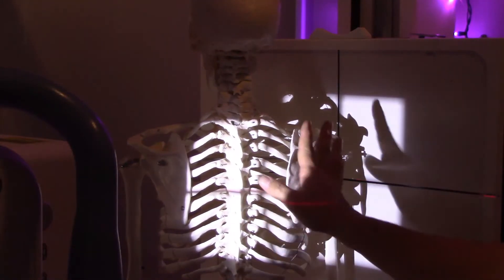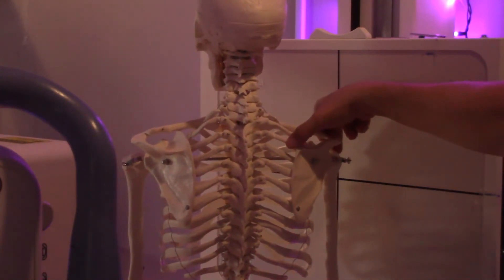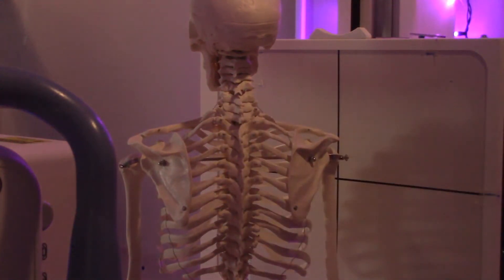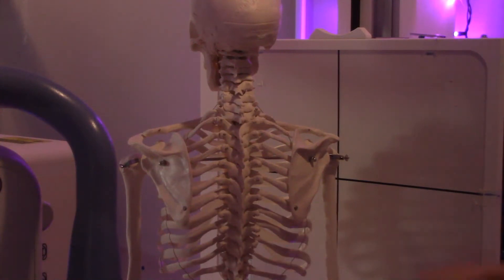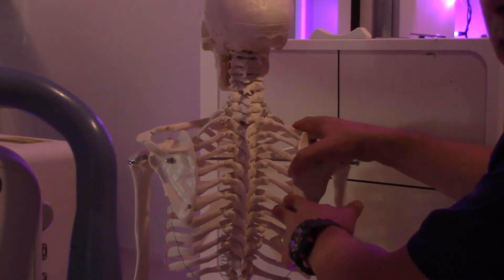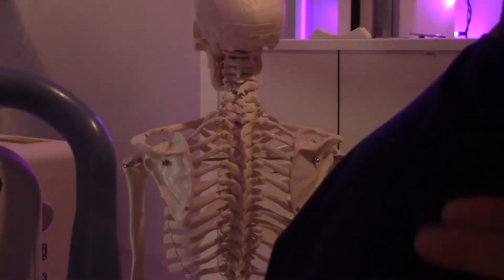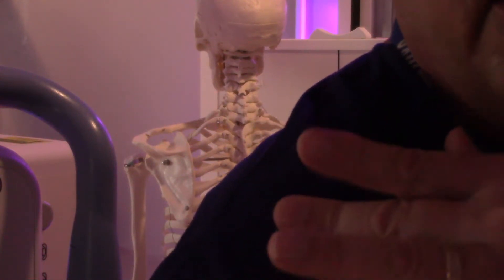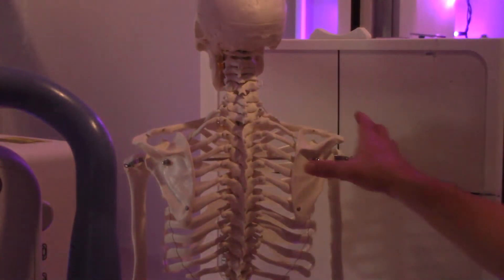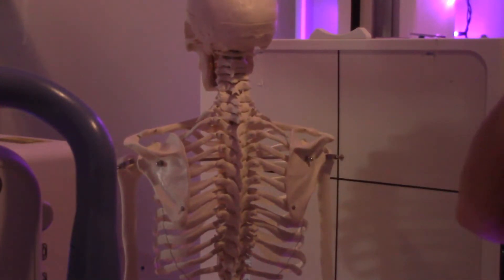You'll notice that when the scapula is perpendicular to the image receptor, there's a little bit of a gap between the ribcage and the scapula — there's some flesh in between there. Now I've got this guy centered up and positioned correctly. If your patient has a lot of adipose tissue on their back, you might have to dig a little bit. That's why I like to use my thumb to find the medial border. The acromion usually is sticking out at the top of the patient's shoulder — it's that bony protuberance. So if I can find that and the medial border, I can line this up straight. Now I'm at the correct level, patient is positioned, and I'm going to ask my patient to suspend respiration while we make this exposure.